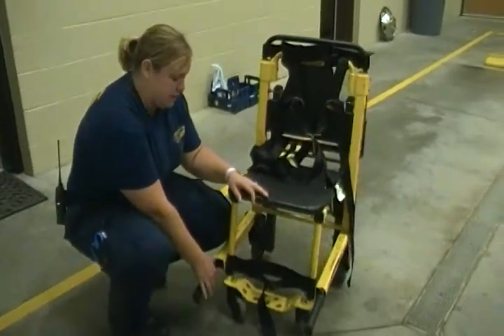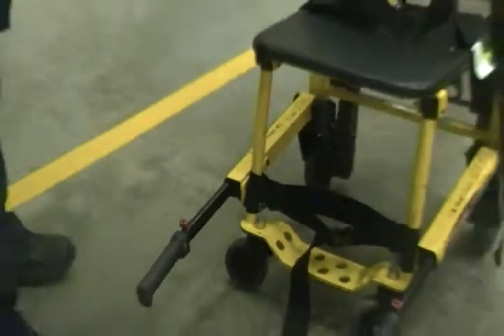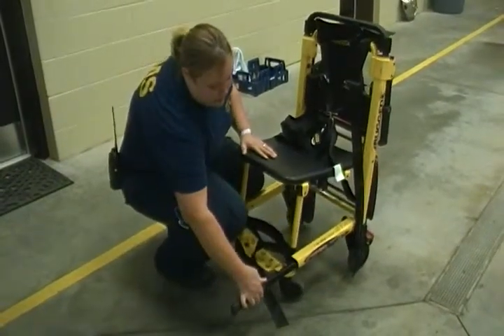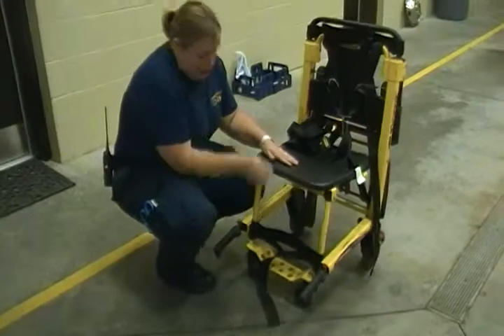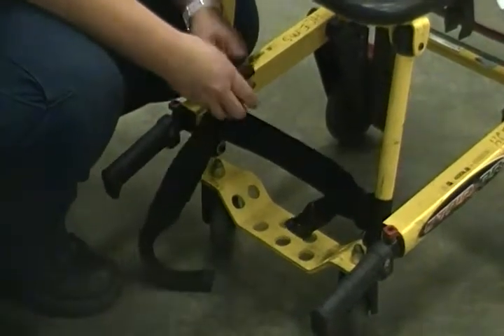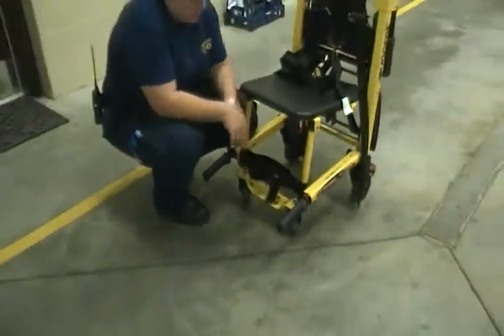Here at the bottom you will find some handles. The foot handles are used whenever you're taking a patient down a flight of stairs — you want to hold onto them down here at the bottom. To release them, you push the red buttons, then they move in and out. Here at the bottom you'll find a foot pedal where patients can rest their feet, and you can secure them with a strap at the feet and tighten those as well.